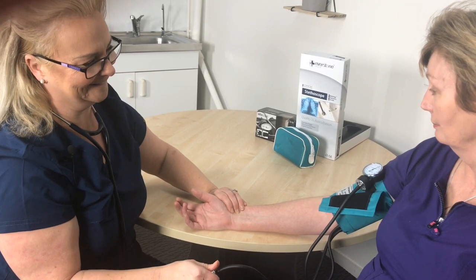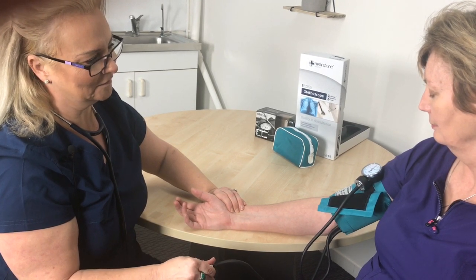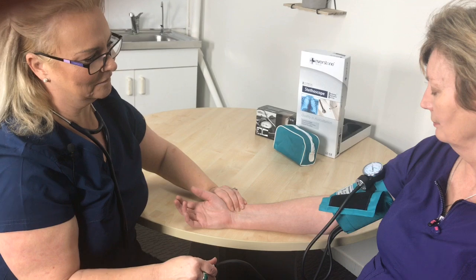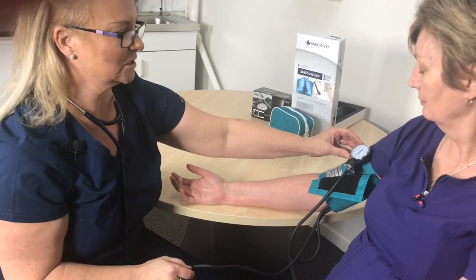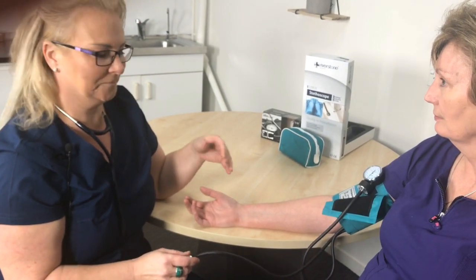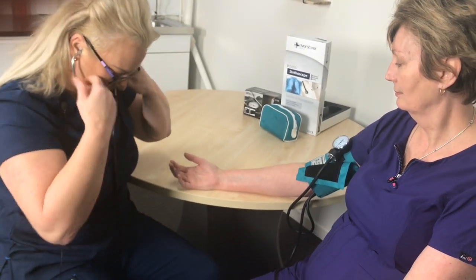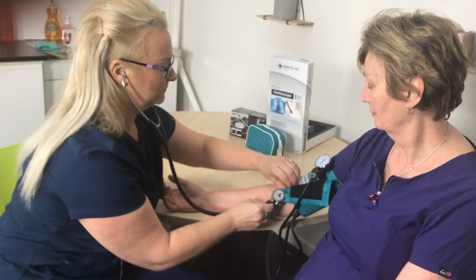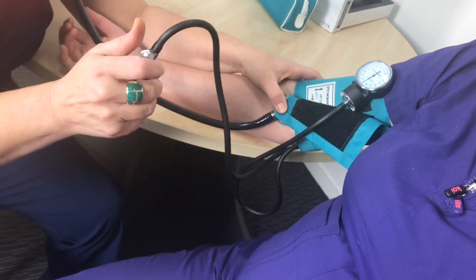It is high. We'll let it down slowly. I can feel the pulse come in just below 120, so that lets me know that the systolic is probably going to be about 120. I'm going to pump up 20 more than that, so up to 140.